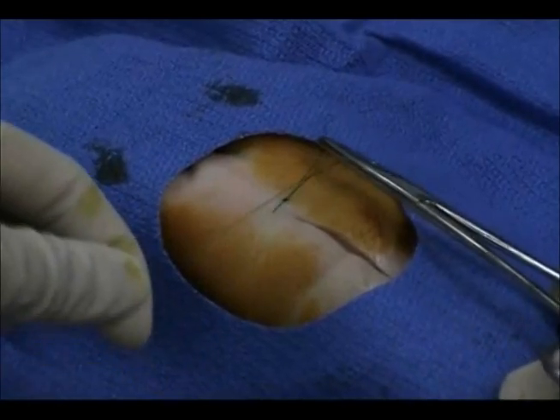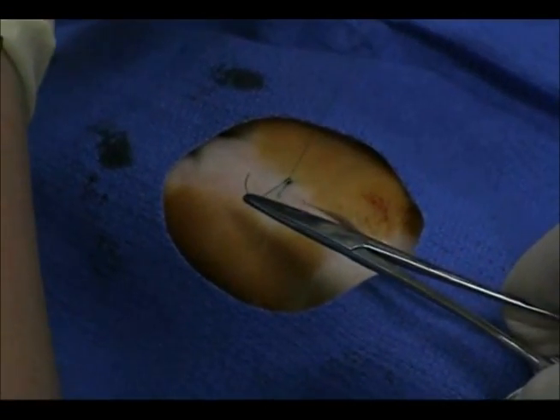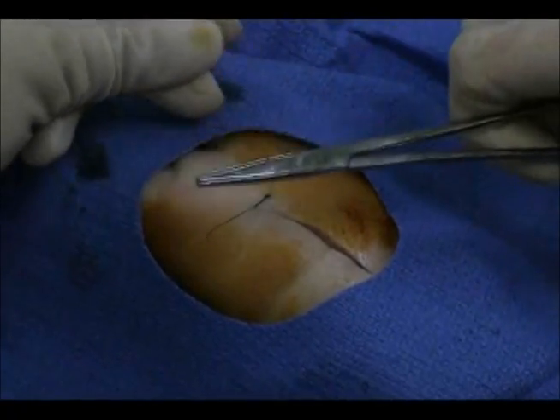As a general rule, you throw in as many knots as the suture number. So, for a 6-0 suture, you would throw 6 knots, which includes the first surgeon's knot. For a 4-0 suture, you would throw 4 knots.